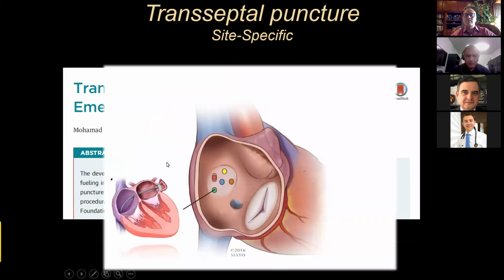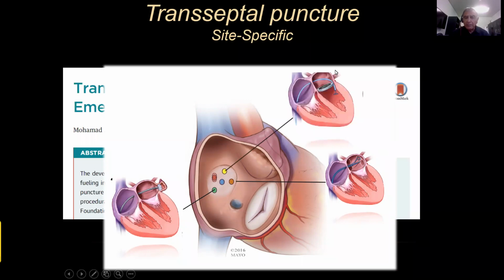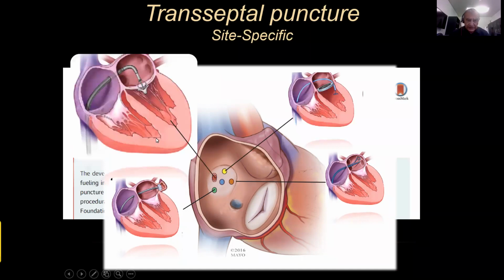So, for example, for closure of the left atrial appendage, the puncture is inferior and posterior. For pulmonary vein ablation, in the middle and anterior. For a paravalvular leak, lateral paravalvular leak, anterior and superior. But for the MitraClip, this is important, posterior and superior. So we have to put the puncture in the posterior and superior projection.